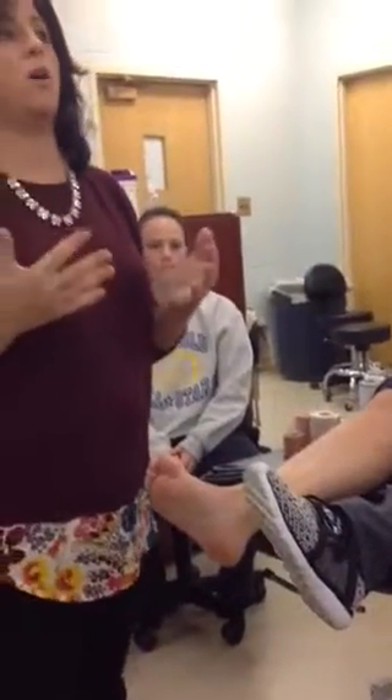This is for somebody who needs push-off and has pain with push-off. What you're going to do is build an external Achilles tendon to help support the injured internal Achilles tendon.